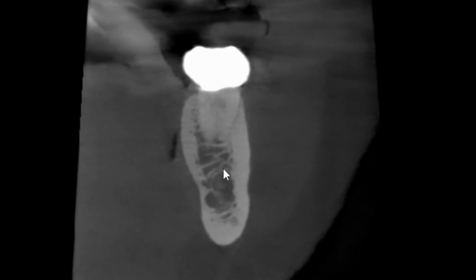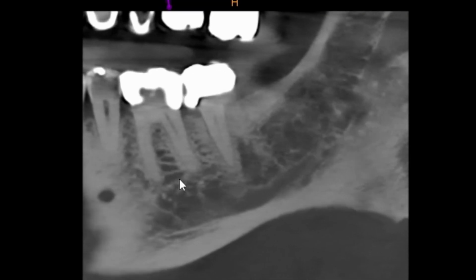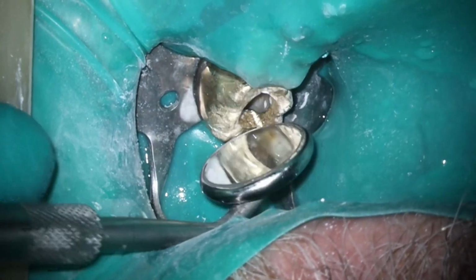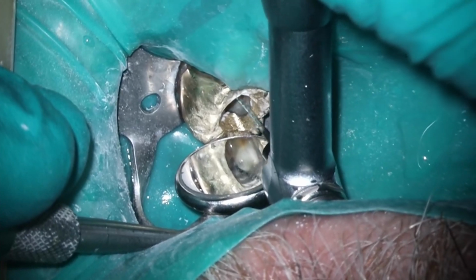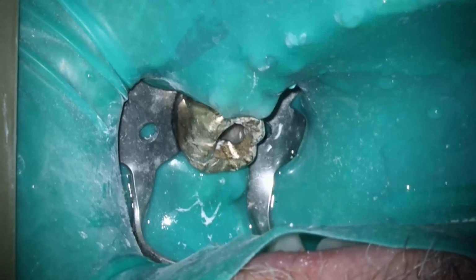And this was the point of this video, is it's very important to realize that the skills that each and every one of you have in diagnosing things using two-dimensional imaging, which you have done for years and years and years, even if you're just starting dental school, you've looked at thousands of PAs, those skills do not translate to three-dimensional imaging, and what oftentimes happens is you're going to over-diagnose. And that's exactly what happened here, and this is why it's very important that when you buy a cone beam, you take some lessons, you take some classes, you talk to people about how to interpret it, or more importantly, send it off to a radiologist who will tell you to correlate everything with clinical findings.